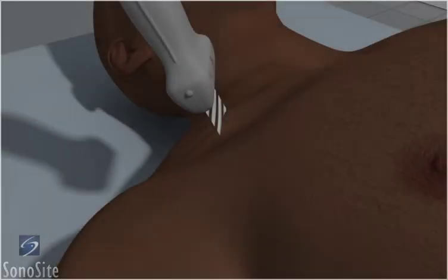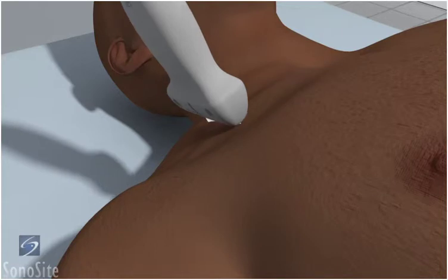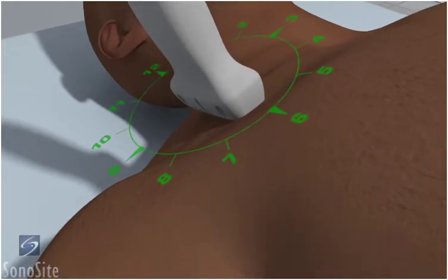The patient is in a supine position with the head neutral. The operator should stand to the patient's right side. The transducer is placed transversely just inferior to the mid portion of the clavicle, with the orientation marker directed to the patient's head at a 12 o'clock position.